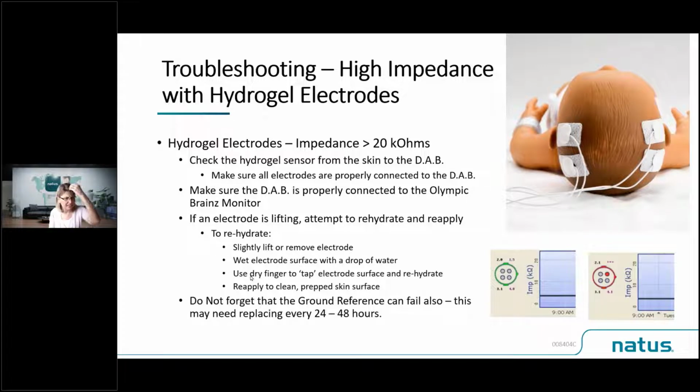If you're going to do that, just lift it slightly, put some water underneath, use a finger to tap it, reapply it. You may need to re-prep the skin, you may need to put a fresh electrode on. And don't forget that the ground or reference electrode can also fail. You may need to re-prep, rehydrate your ground electrode, and think about replacing it every 24 to 48 hours.